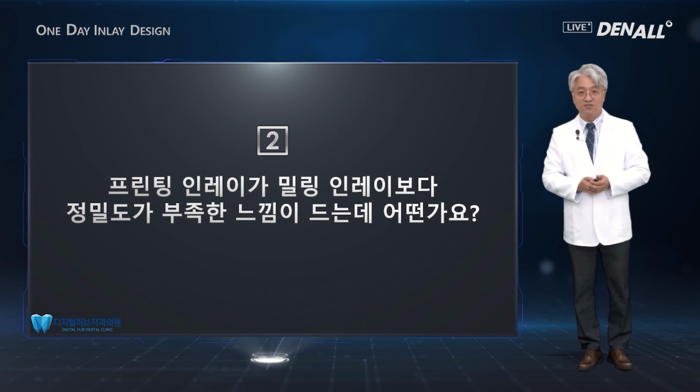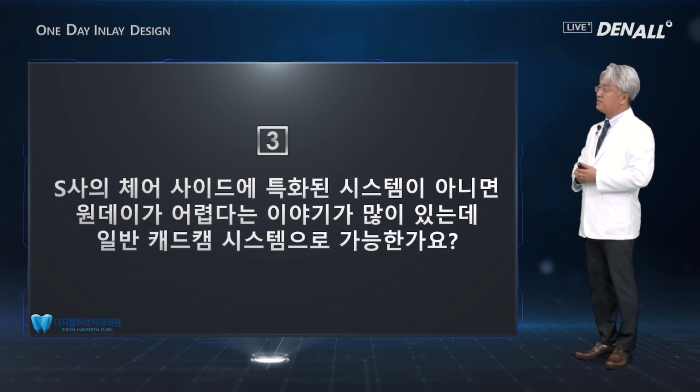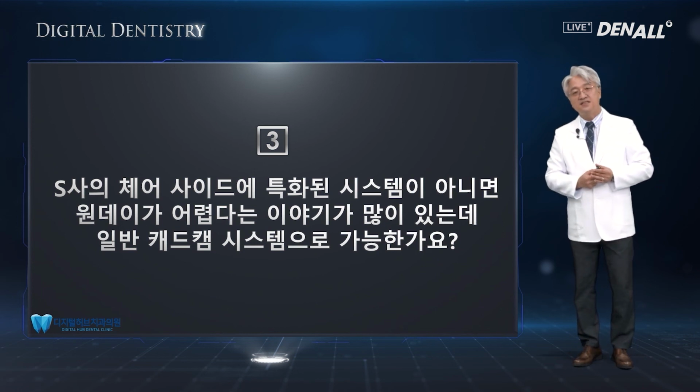in my opinion. So third question, the company has a chair-side customized system, and without that system, many say one day would not be possible. Can we use a general CAD-CAM system for one-day approach?